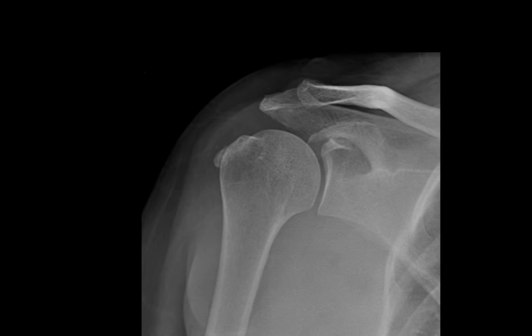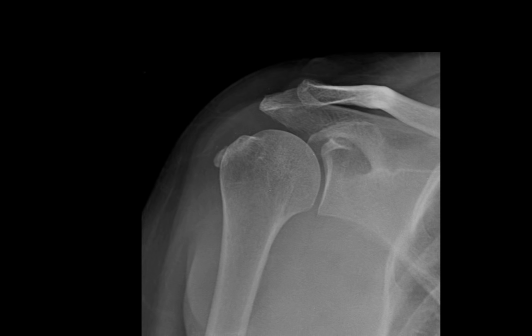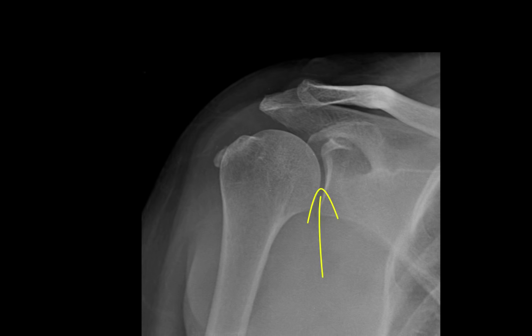Important to note here is that the humeral head has a nice asymmetrical shape that makes it look a little bit like a walking stick. When it becomes symmetrical, it's been rotated, and that's actually a pathological sign in the context of a posterior dislocation. There's a nice space between the humeral head and the glenoid fossa — we know it's in the right place, because that's where the synovial fluid of this synovial joint lies.